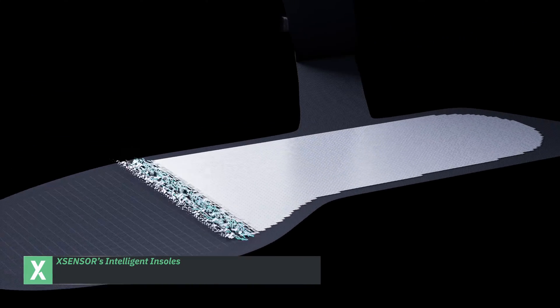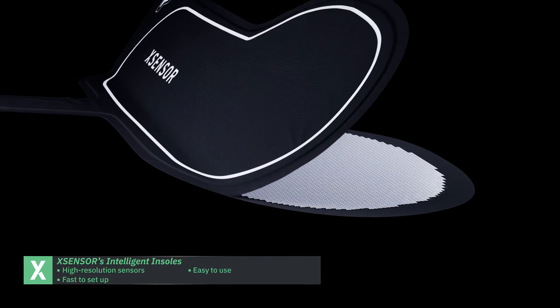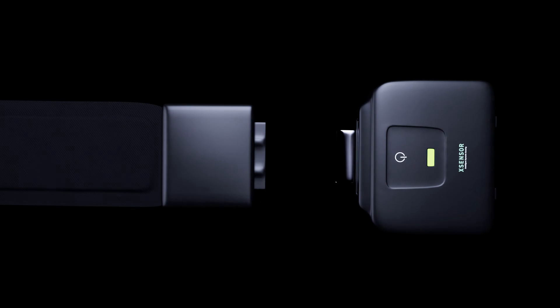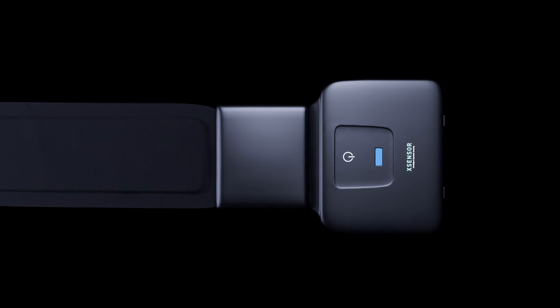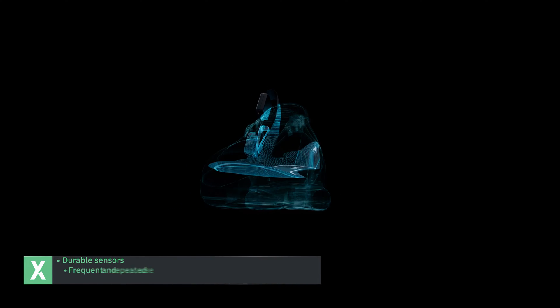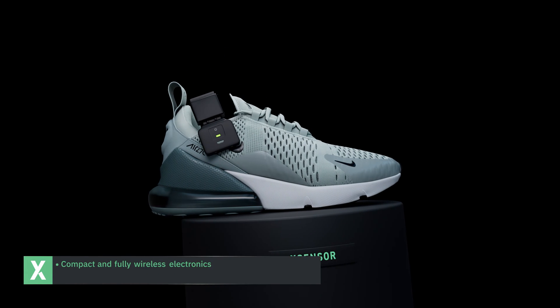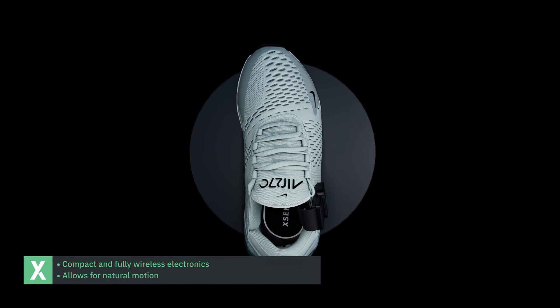X-Sensor Technology's state-of-the-art intelligent insoles use high-resolution sensors that are fast to set up, easy to use, and undetectable to the wearer. The durable sensors, designed for frequent and repeated use, are thin and flexible. The compact, fully wireless electronics attach to the wearer's shoes, allowing for natural motion.